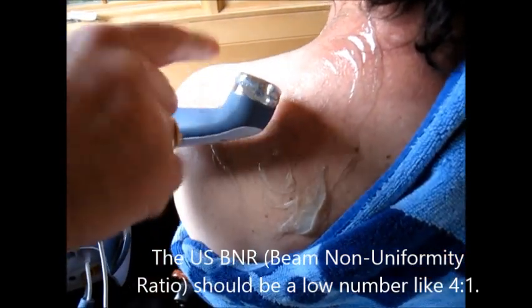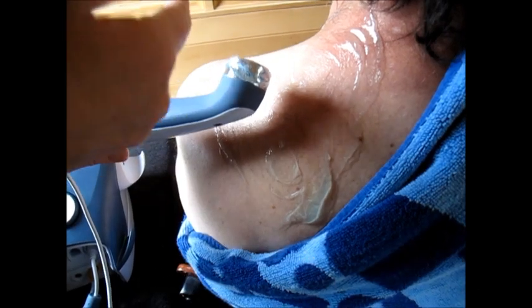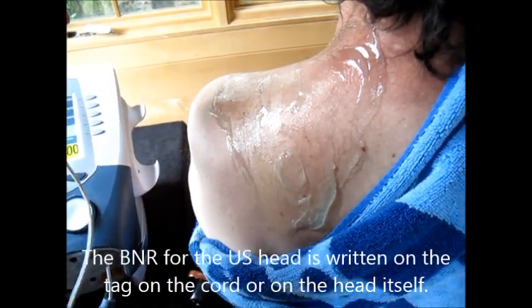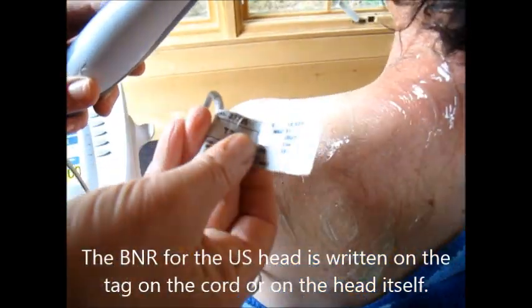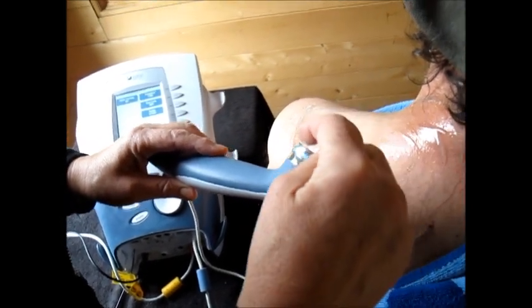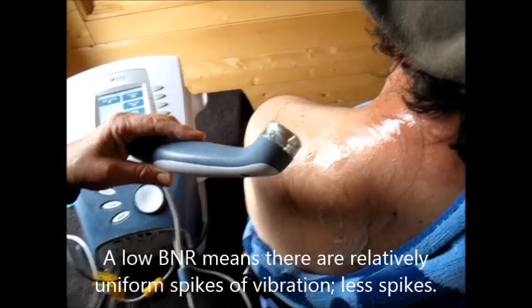Remember the BNR — beam non-uniformity ratio. Ideally it's 4 to 1, but most machines these days are 5 to 1. Anything above 6 to 1 is no good. So look at your ultrasound heads — when you buy one, look at the wire and see what it says. This one has a BNR of 5 to 1. That means there's conformity in the vibrations coming out without spikes. If it were 14 to 1, that would scare the patient and could burn them.